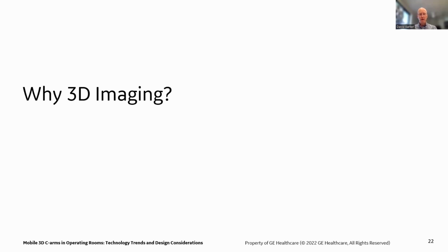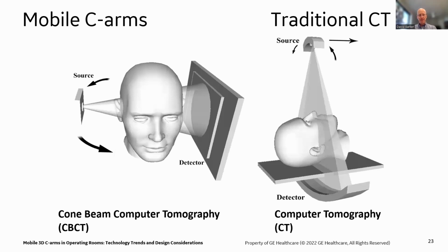So why do we need 3D images? What does a 3D image give you that you can't get from building this model in your head from the 2D images? Well, let's just discuss for a minute how a 3D image is constructed. They're actually made by gathering a whole bunch of 2-dimensional images. The traditional way this is done is by projecting and exposing small strips of the image, almost like the strips you'd get when you put something on a copier, and it just scans little strips at a time, and then finally compiles your full 2-dimensional image that way.